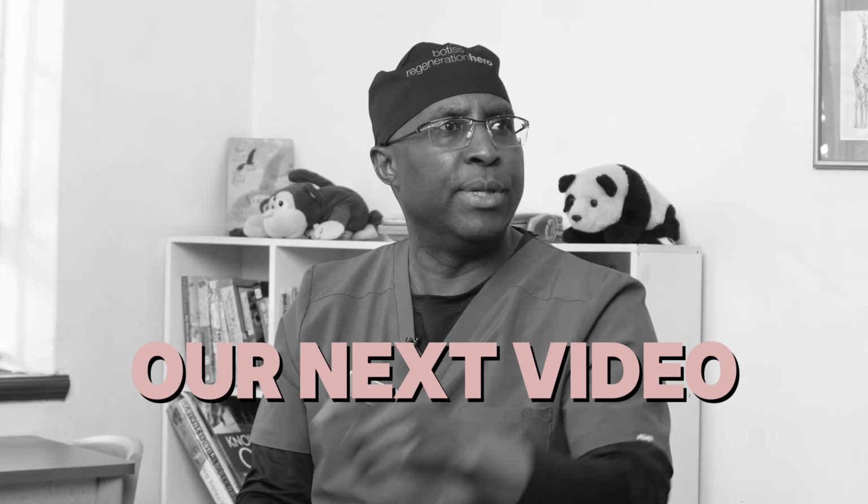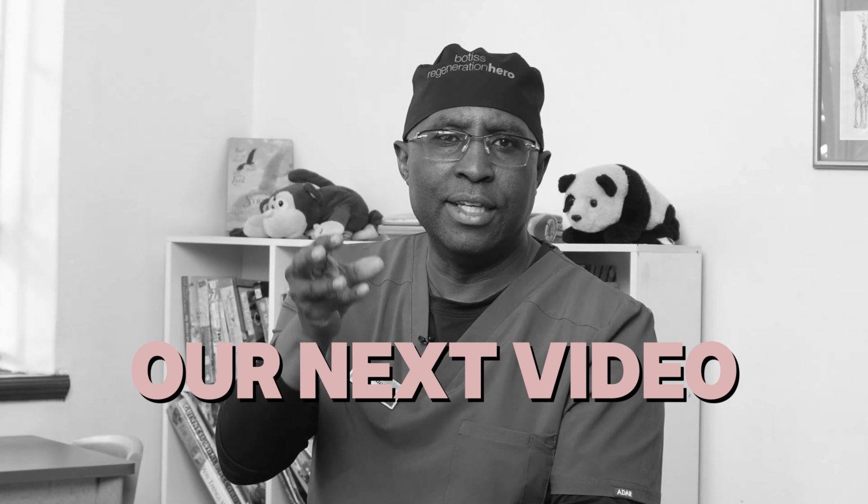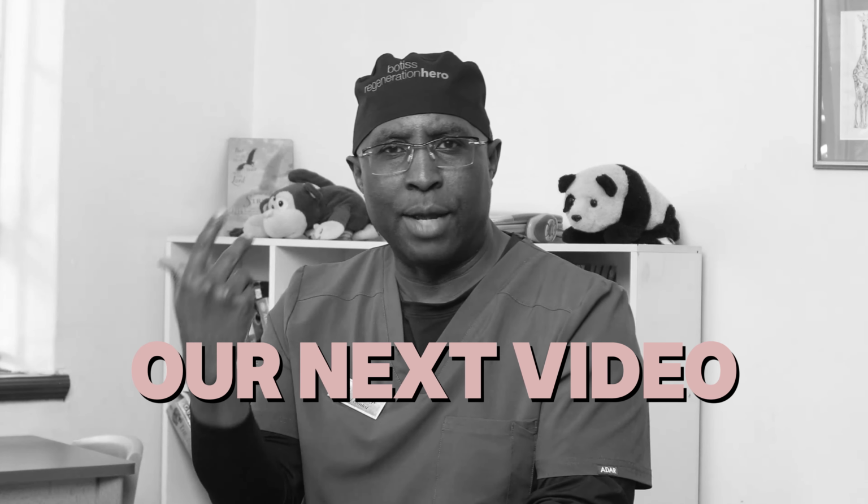When we want to find out if there are cavities in between the teeth, then we go for the intraoral x-ray. I will be going to another part of the clinic, and I will be able to demonstrate and show you how an intraoral x-ray works and how a panoramic x-ray works.